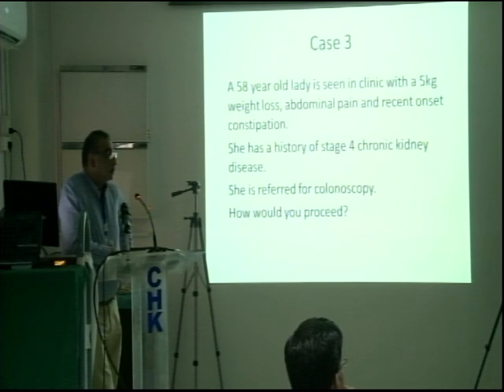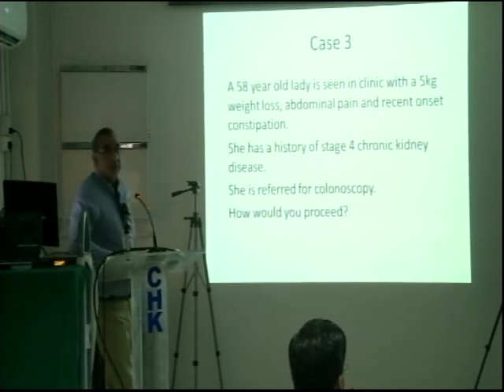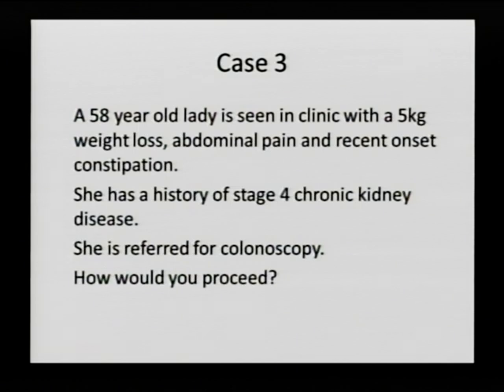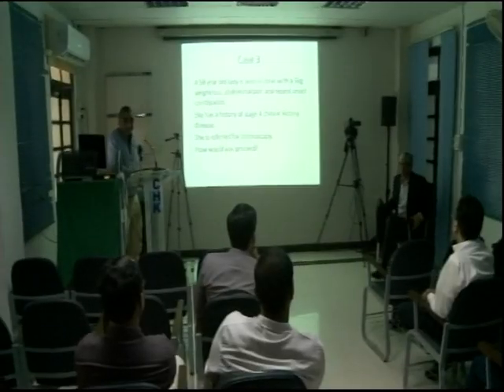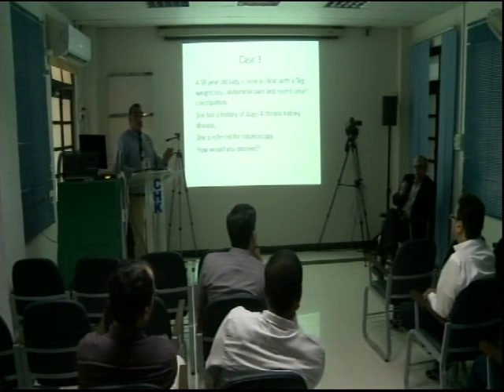You know why you want to do that is probably you want to avoid bowel prep. Because colonoscopy invasive way, I don't buy that. Done properly, colonoscopy is as safe as anything else we do. I tell my patients the risk of colonoscopy damage is less than you coming to my clinic. There is more risk of you getting run over by a car, hit by a car, or by a truck. But the point that he's making here is twofold.